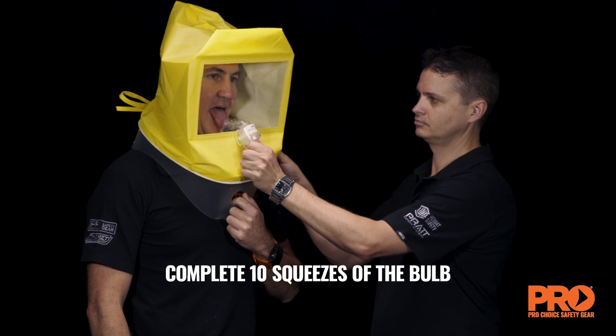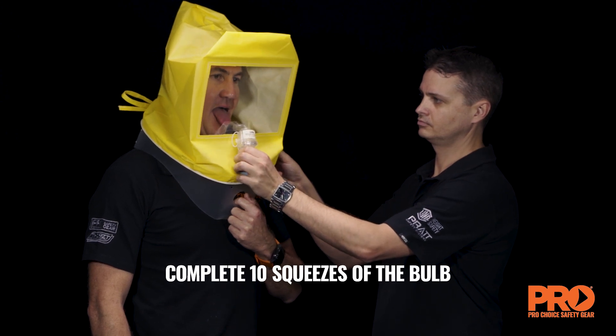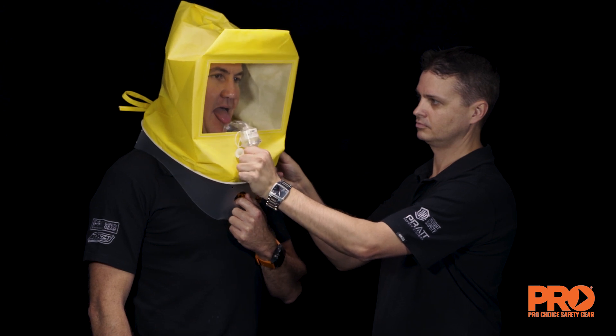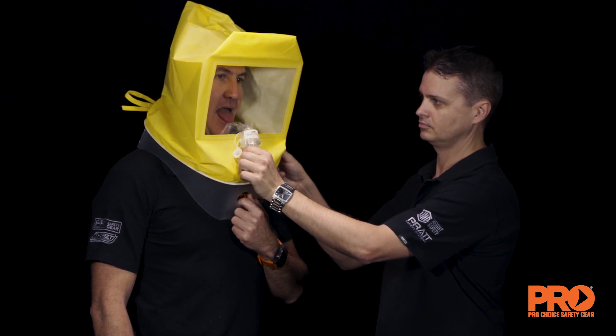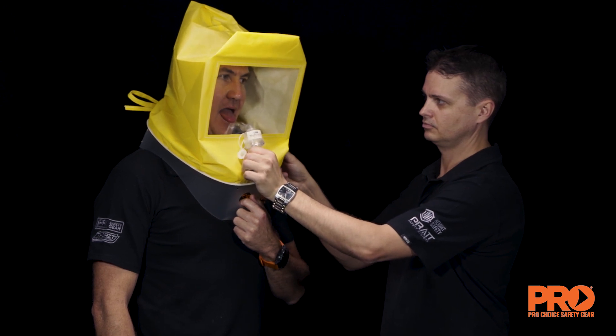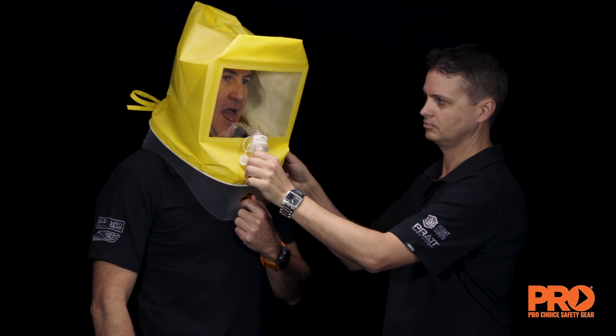Both plugs on the nebuliser must be removed from the openings during use. The nebuliser must be held in an upright position to ensure aerosol generation. A fine mist should be visible. Ask the test subject if they can detect a bitter taste of the solution.